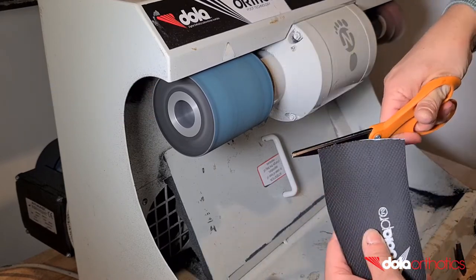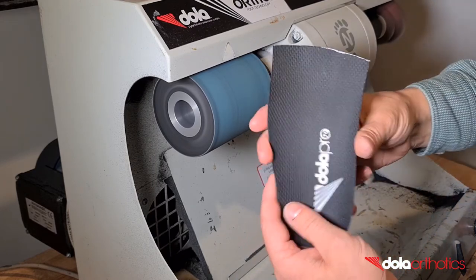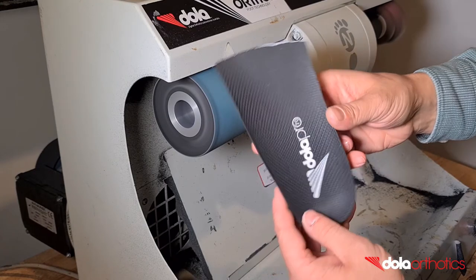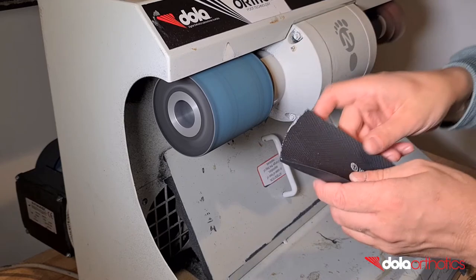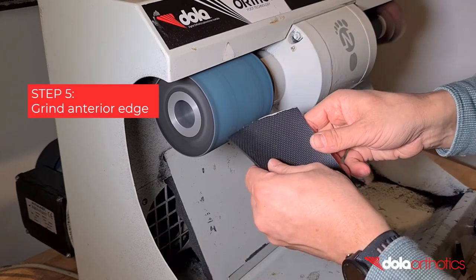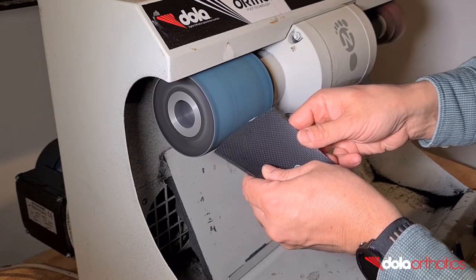Hold the medial and lateral sides of the orthotic shell and place the anterior edge of the orthotic shell against the grinder and finish the smooth curve. Change the alignment of the orthotic from horizontal to vertical to create a smooth curve. Remove small sections of the orthotic at a time until you become comfortable and check your progress against your guideline.